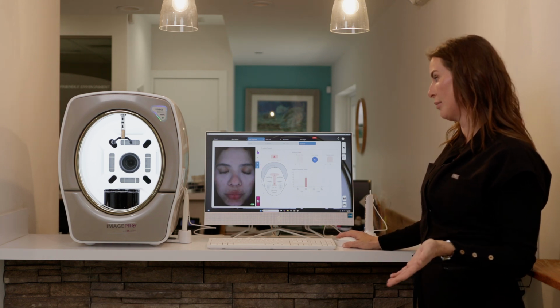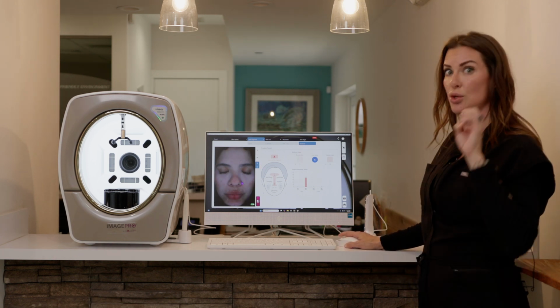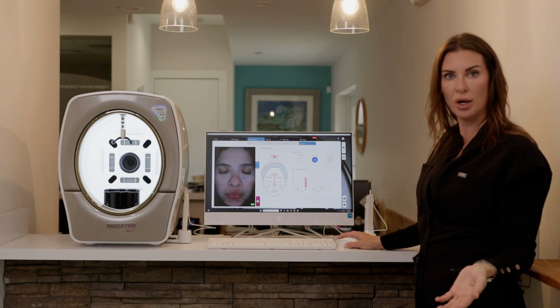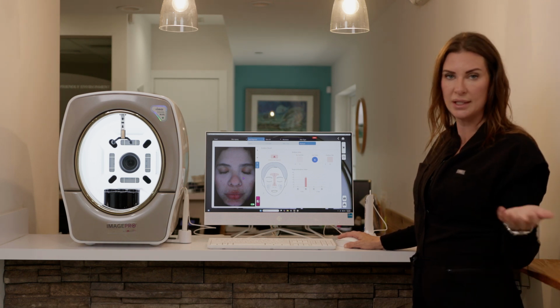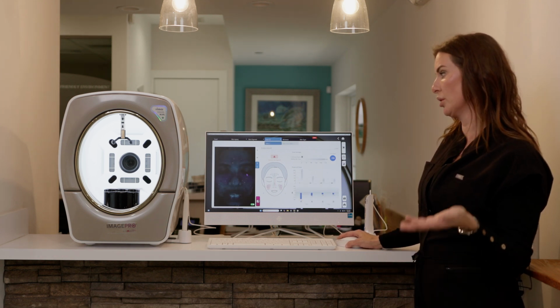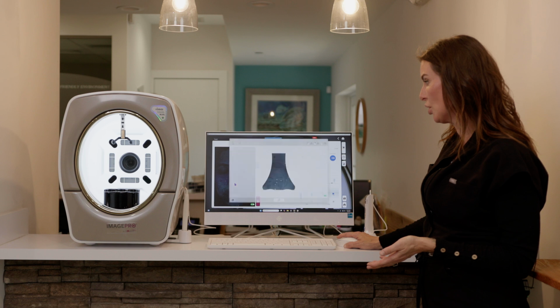Redness, again, she doesn't have much at all, but if they were to see rosacea, you would see big pops of red, and that would be your opportunity to sell any of your products for rosacea. IPL and Nd:YAG are great for that as well. Skin oil, we touched on this earlier. She doesn't have a whole lot, but I am going to show you.